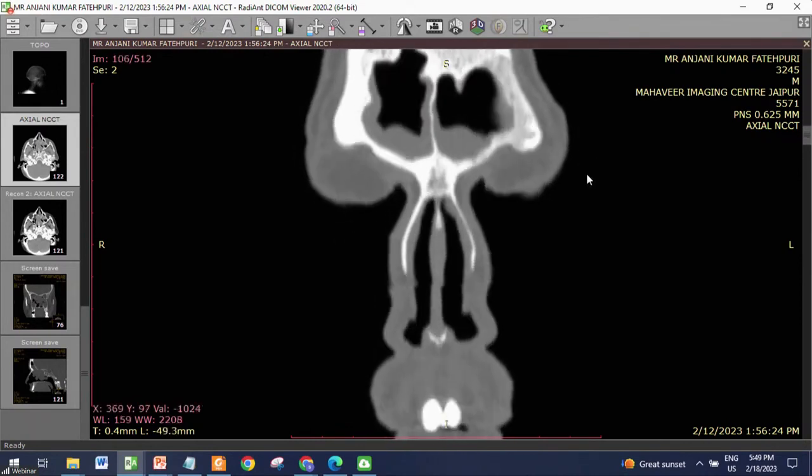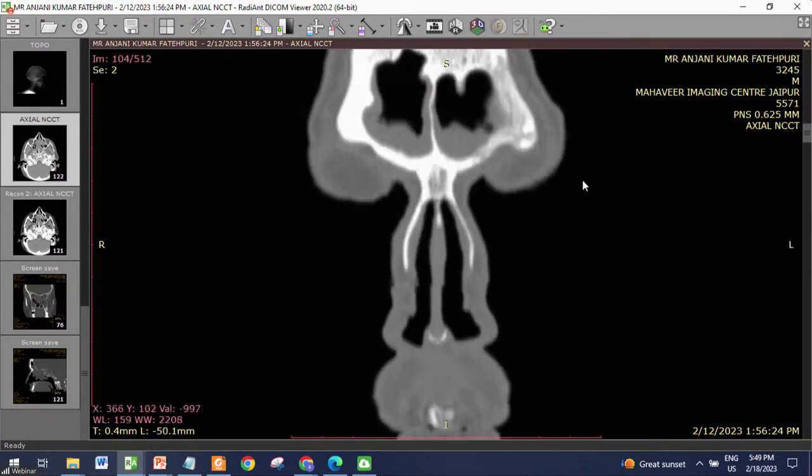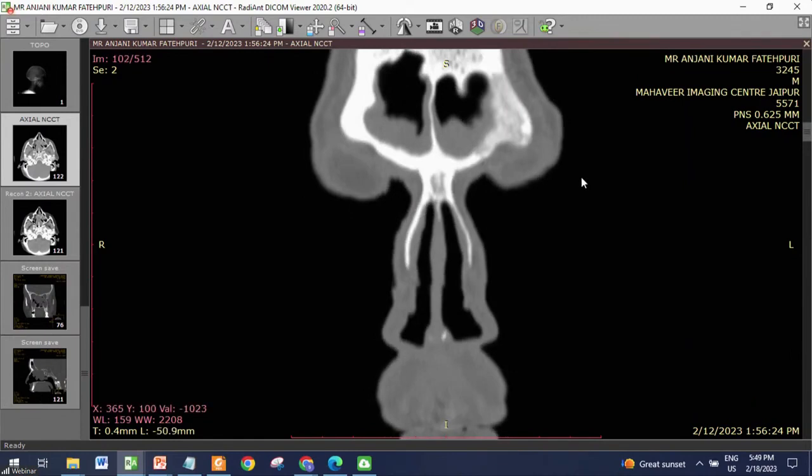Sir, there are some dissolvable packs which need not be removed. Do you have any experience with that? Merogel packs are available, but Merogel induces a lot of fibrosis. So it has been disregarded now, and a lot of people who were using it earlier have given up.